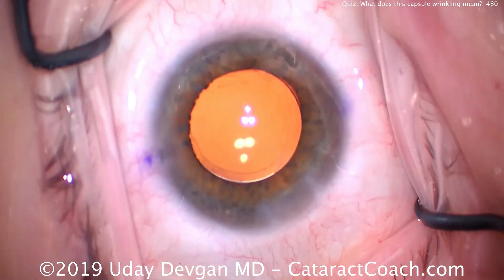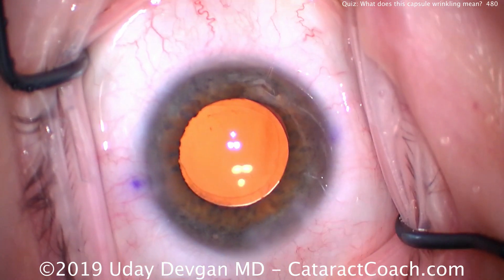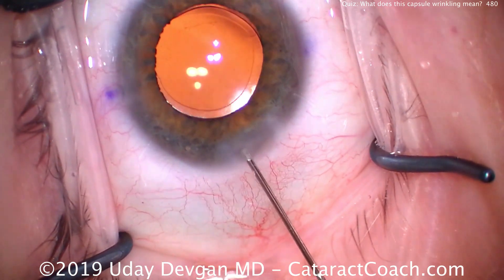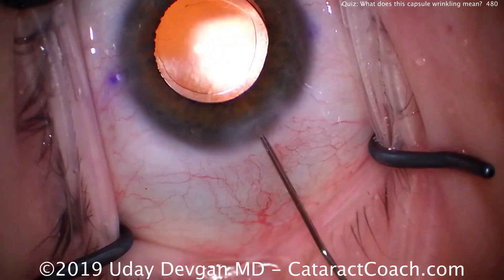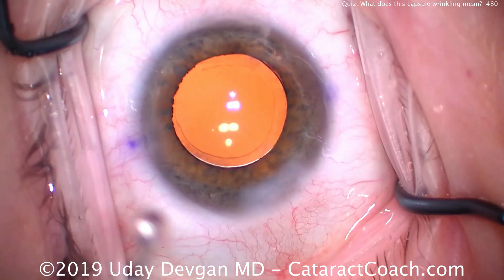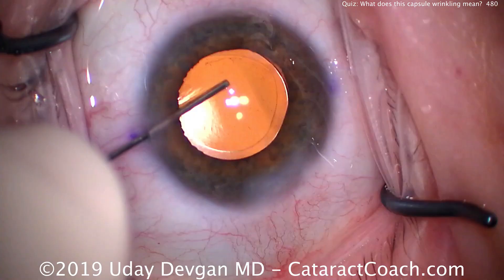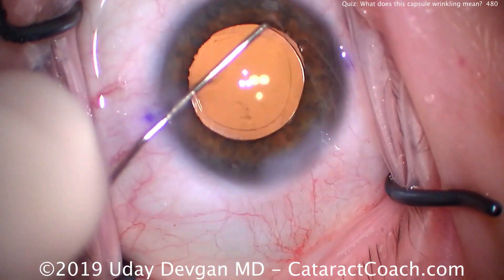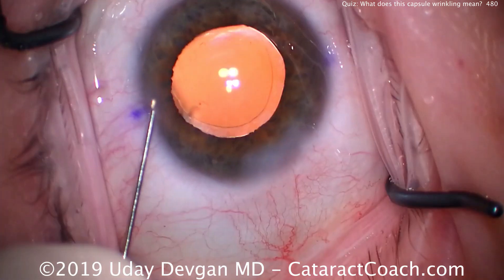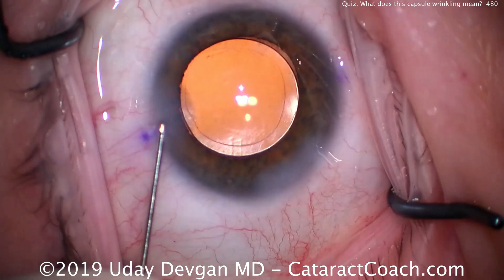This patient already has significantly constricted visual fields from retinitis pigmentosa, and we're doing this surgery to primarily help her central visual acuity. After cleaning up nicely, remember to check the patient in the initial post-op period — the first few months after surgery. If there is any anterior capsular phimosis, use the YAG laser to make relaxing incisions on the anterior capsular rim, usually just in the four cardinal meridians at 12, 3, 6, and 9 o'clock. That will help prevent a phimotic ring from forming, and this patient can and will have a very nice visual outcome. Next time you see those wrinkles on the anterior lens capsule, you'll know those zonules are pretty weak.